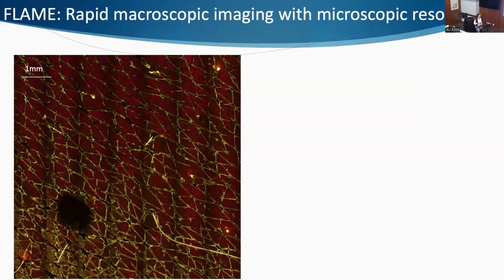You need to image at different time points, and it's very important to be able to go back to the same location. This is one thing we are interested in when using this large scanning area microscope.